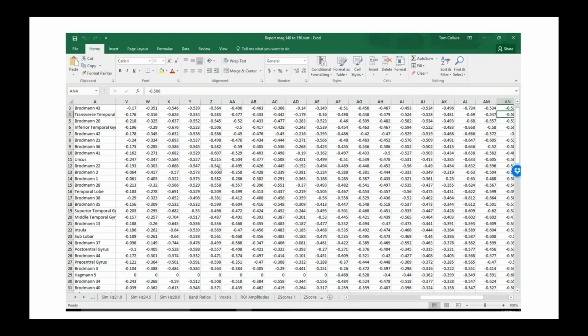And generally what we find when we stimulate is there is a reduction in the endogenous frequency content of the EEG. Might be counterintuitive. You might think, oh, but we're stimulating and producing the rhythm. Well, the evoked potential itself is very tiny. It's just 1 or 2 microvolts. But more importantly, the brain stops producing energy at the frequencies when you stimulate repetitively at 7 and 10 and all that. So it's interesting.